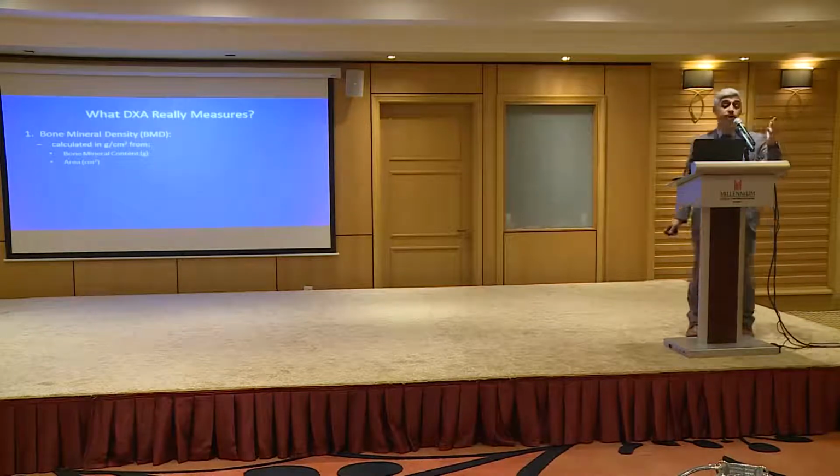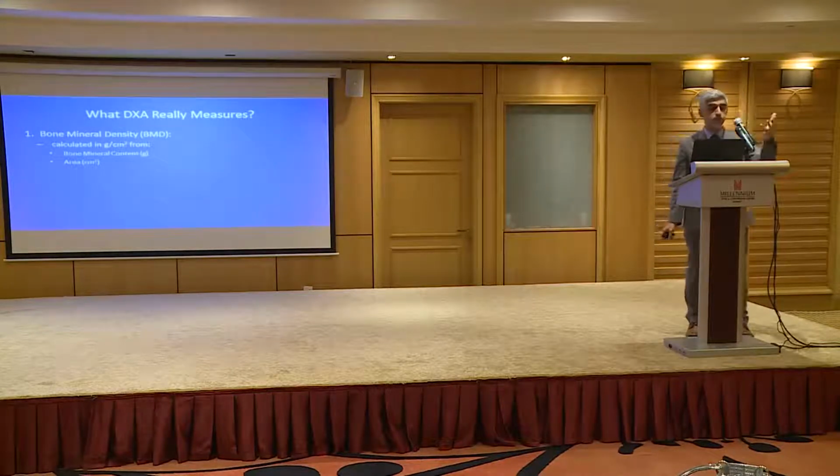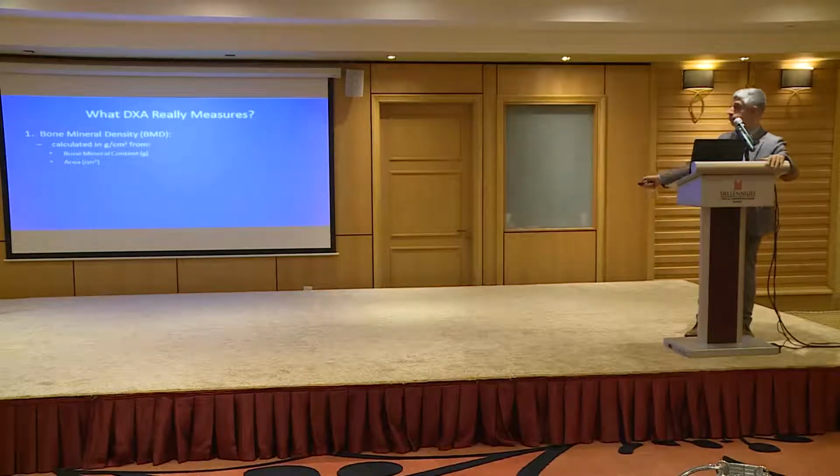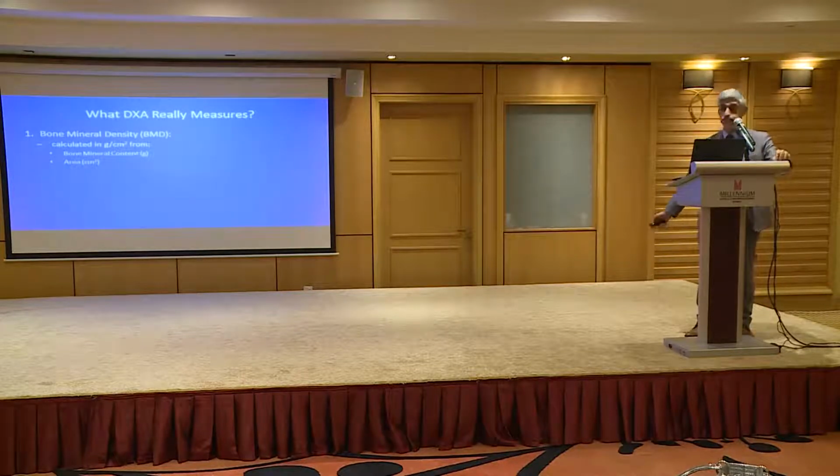So what does a DEXA scan really measure? It measures bone mineral density, BMD. And what is BMD? It's content over an area. So it's the bone mineral content of the bone itself, over the area that it was measured. That's what BMD actually is. So it's in grams per centimeter squared.